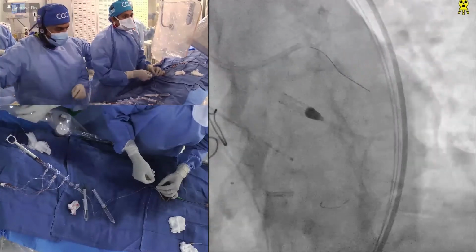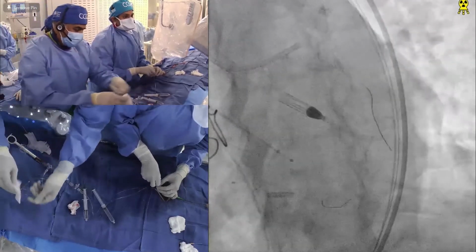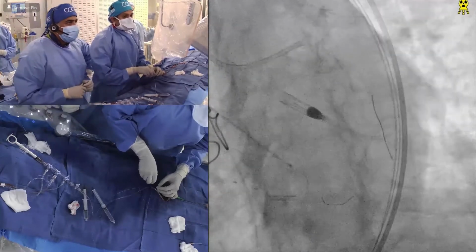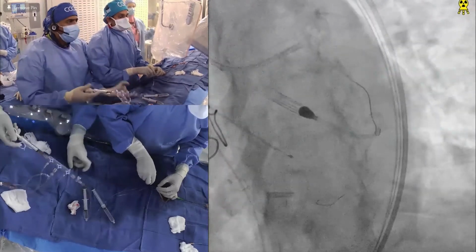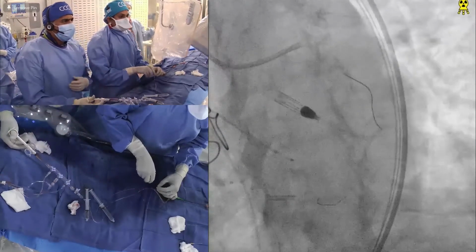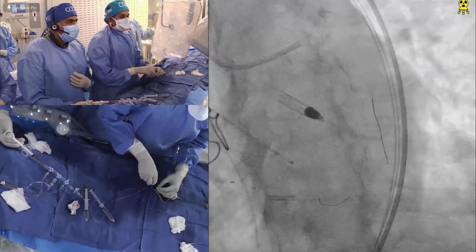Now many people are very much against the 1.25 burr. I can tell you one of the reasons they say is that it gets stuck. Again, we probably do the highest number of rotablations in the world, about 60 per month. Our burr, if ever stuck, was never a 1.25. It was either 1.5 or above, in an unexpanded stent or otherwise. So the key is, as long as you did the technique that Anu did, slow movement and advancement, we have never been stuck. Yeah, I know a lot of people think this. I would not say it's a common myth, because there have been some cases where people have said that the 1.25 burr traps the most, the burr is stuck, and so on.